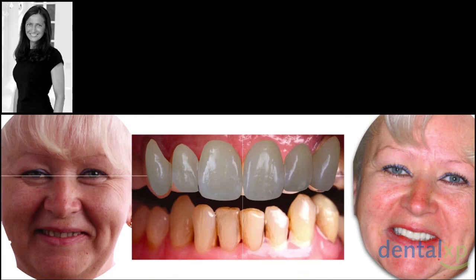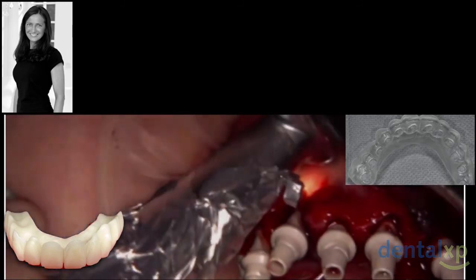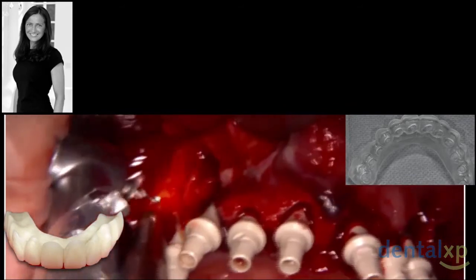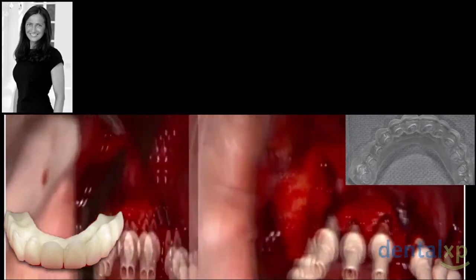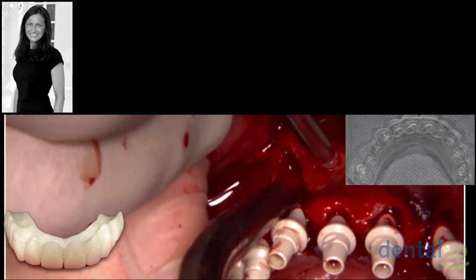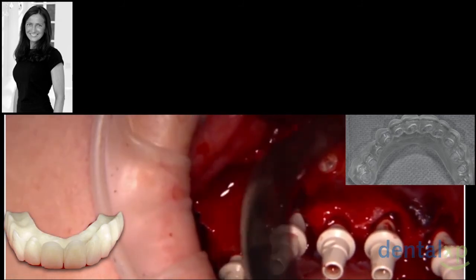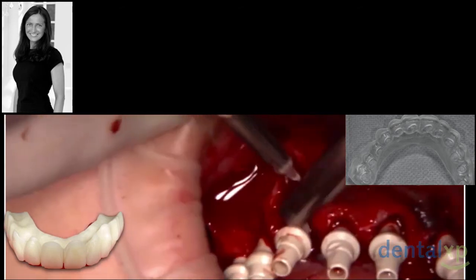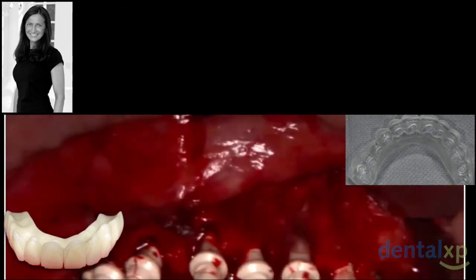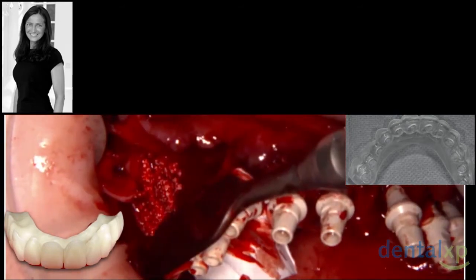This is a lady who needs to have all the upper teeth extracted. We did that time just an aesthetic guide, not a digital guide, and the provisional made in advance. The surgery will be done in an immediate placement procedure. The horizontal and vertical defects will be solved by sonic weld grafting of the defects, as we talked a few minutes ago, and collagen membrane will be placed on top of the polylactid membrane which we used.